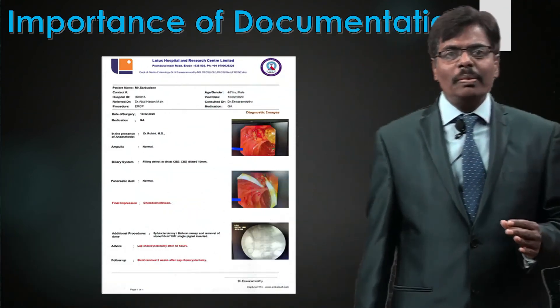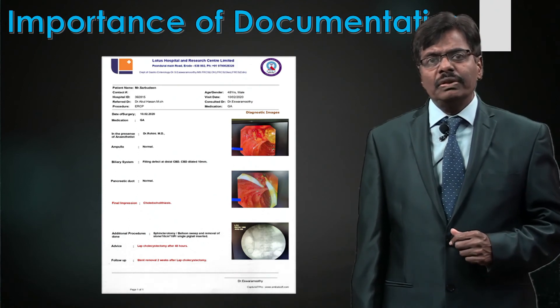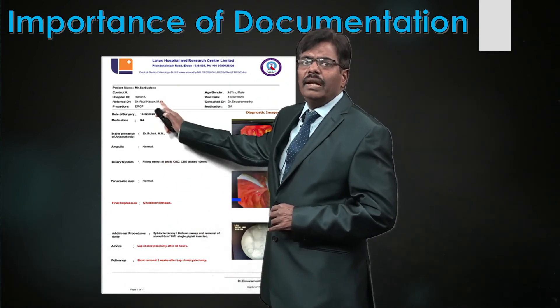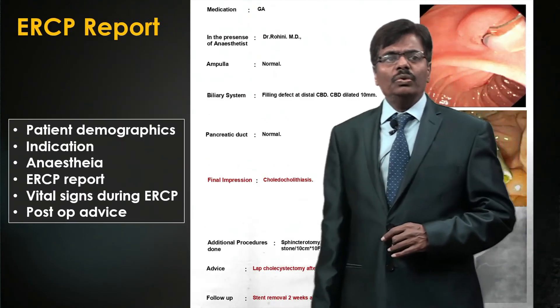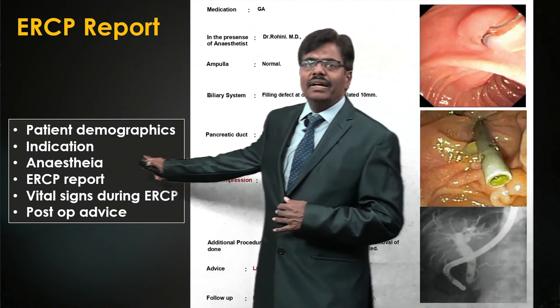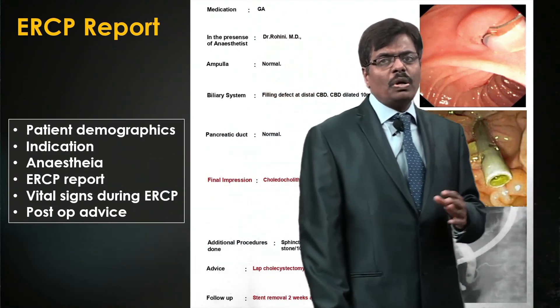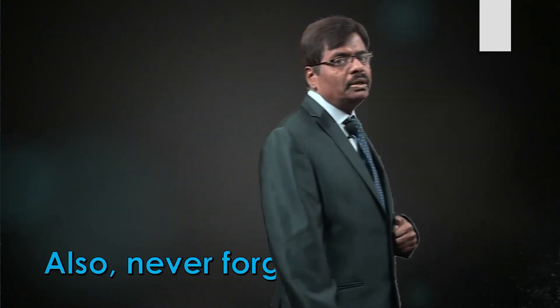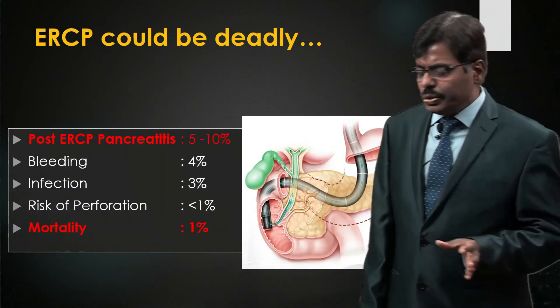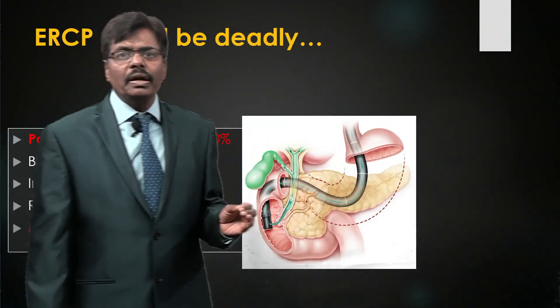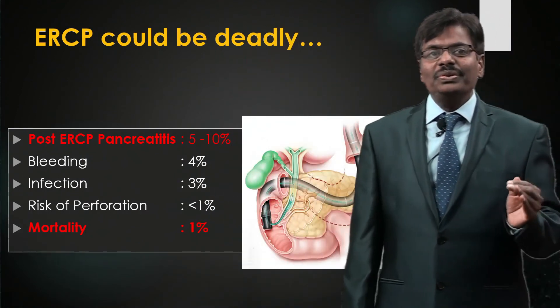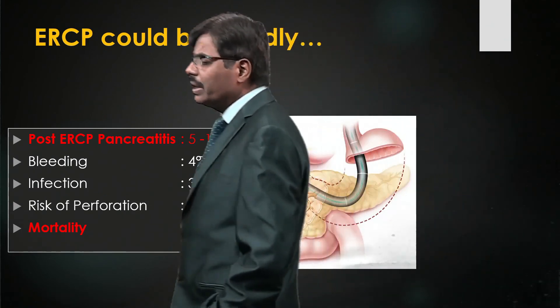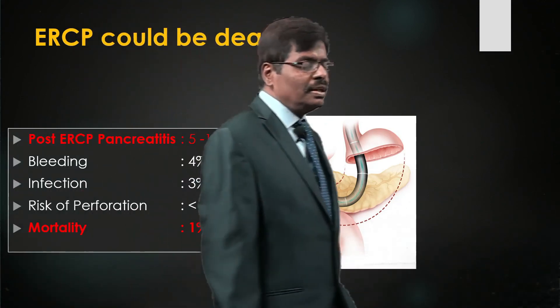After deflation, take the stone out. If malignancy is suspected, you can perform a cytology brush or use SpyGlass. The principle here is the importance of sphincterotomy with endocut, and the benefit of sphincteroplasty and balloon sweep. Always maintain constant communication with your staff nurse during exchange procedures — she needs to know how to railroad the stent. A single pigtail stent has now been placed.